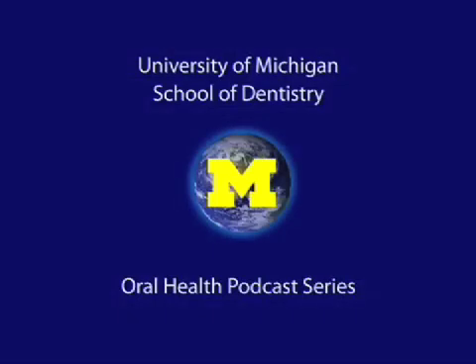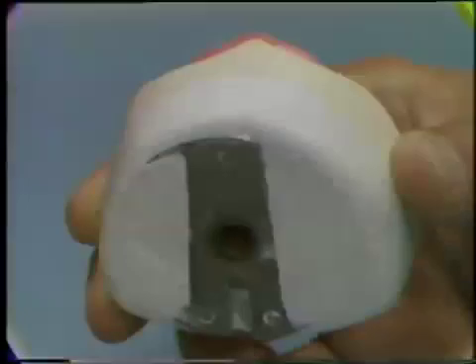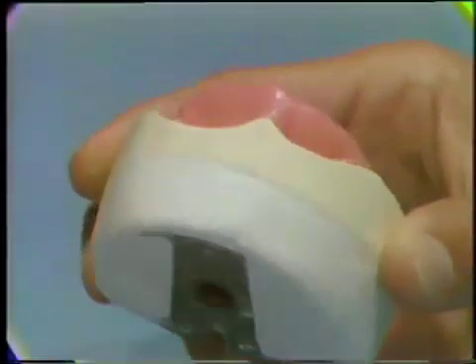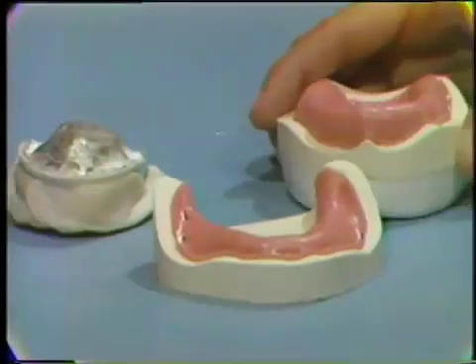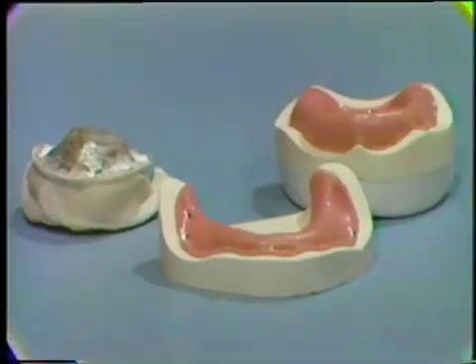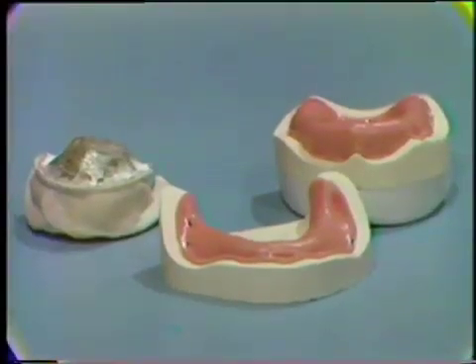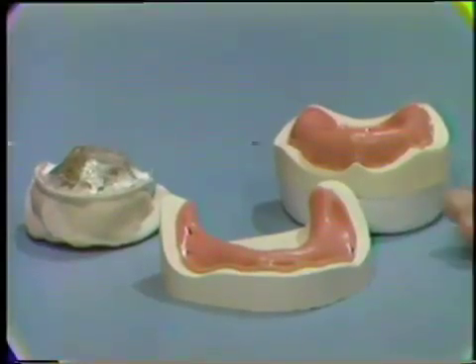Welcome to the University of Michigan Dentistry Podcast Series, promoting oral health care worldwide. In the preclinical course, the student has been issued a maxillary master cast already mounted on an articulator ring, special vinyl base plates, and a new mandibular master cast with a mounting guide which provides orientation to the articulator that will allow the proper setting of the technique teeth.